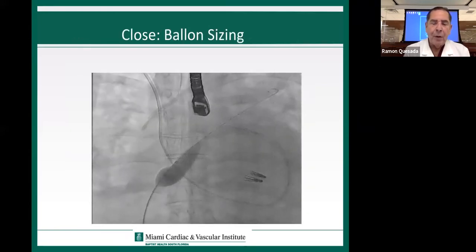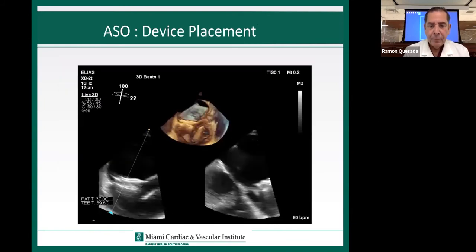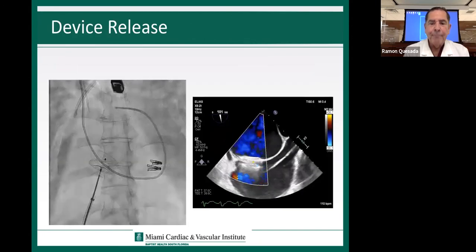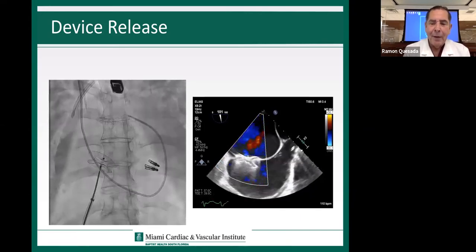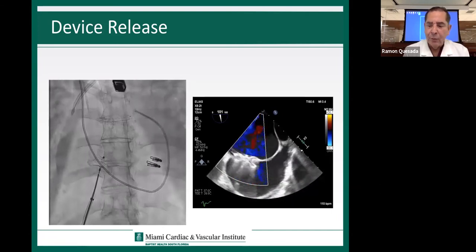And how do you do that? Well, we always, in these particular patients, want to make sure that when you close it, you're not going to make things worse. So we measure the pulmonary pressures, et cetera, and then size the device like you're doing with a congenital ASD, and then proceed with closure with an ASO device, as you can see here. And then this is the final result, with the ASD closed. This is a little bit more common complication. In our experience, we don't see it that often, but when it happens, you have to be ready to proceed with closing.